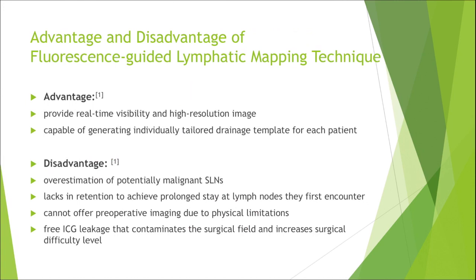And ICG lacks the retention level that 99m technetium nanocolloid has. And as mentioned before, preoperative imaging cannot be achieved due to tissue attenuation. Also, leakage of ICG will contaminate the surgical field and increase surgical difficulty.